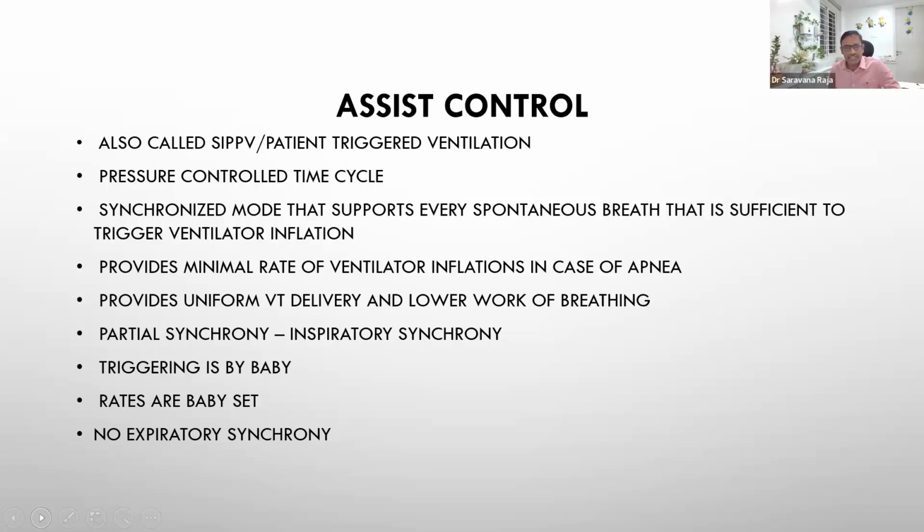It also gives only partial synchrony because only inspiratory synchrony occurs. The triggering here is also by the baby. The rates are set by the baby. And compared to SIMV, here the rates are set by the baby. And there is no expiratory synchrony because it is a time cycle one. Next slide.